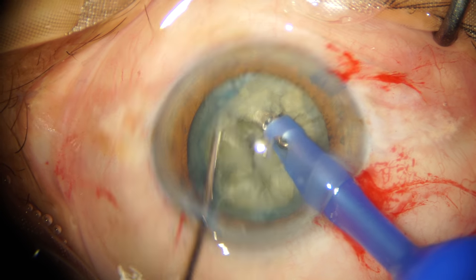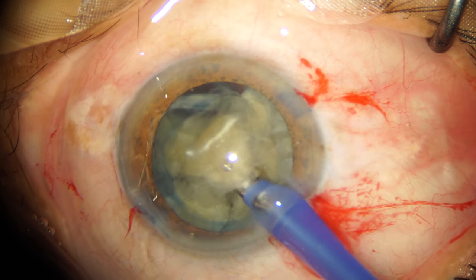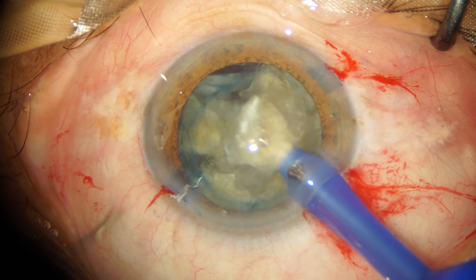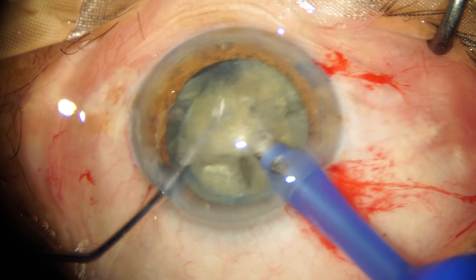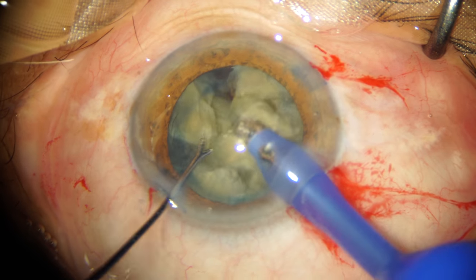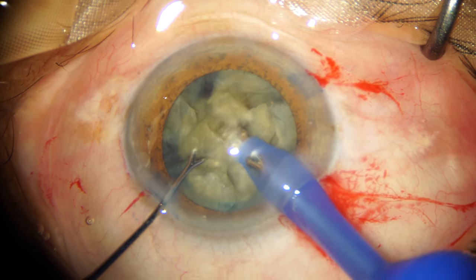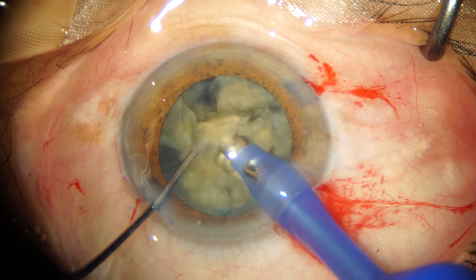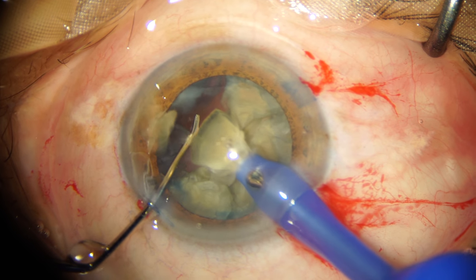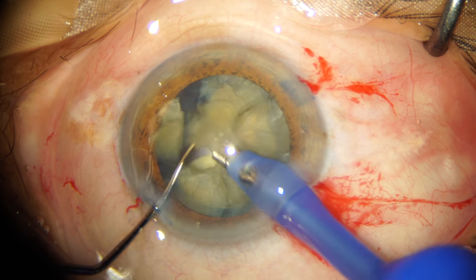As you can see, I have been successful in breaking the nucleus into six small pieces. I remove my chopper from the anterior chamber and insert a blunt second instrument — a Y-nucleus manipulator. I prefer not to keep any sharp instrument in the anterior chamber once chopping is complete, as I don't want to inadvertently hit the capsulorhexis margin or puncture the posterior capsule. I always keep my second instrument behind the pieces I am emulsifying to protect the posterior capsule.